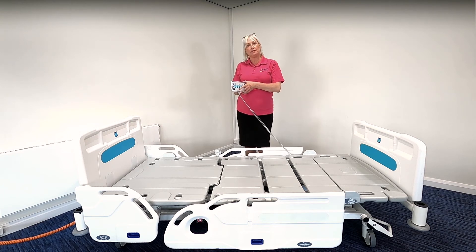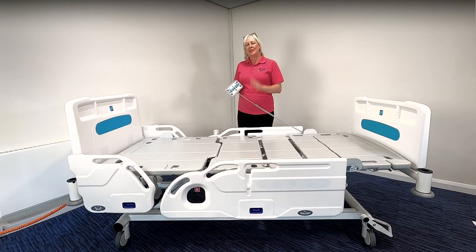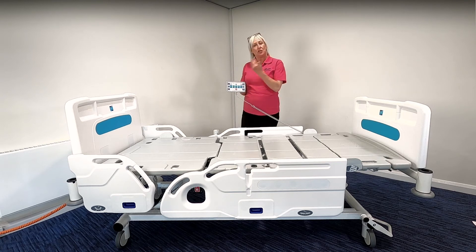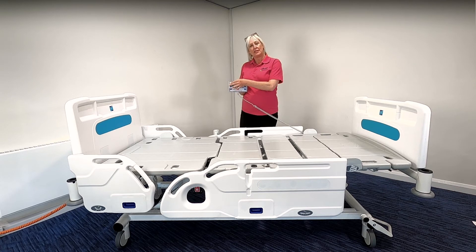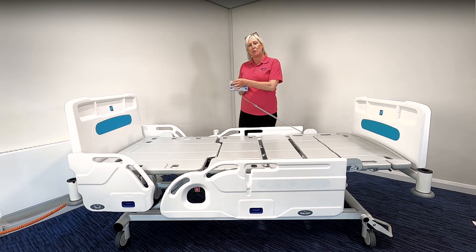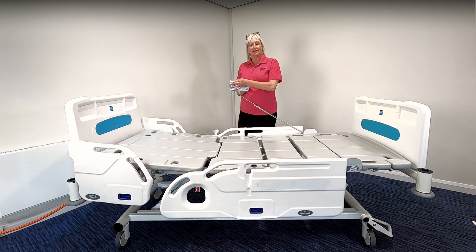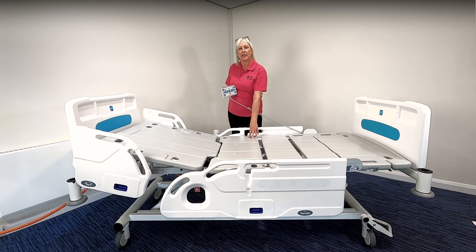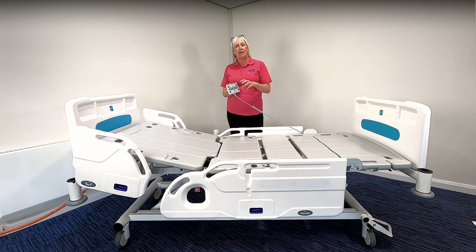Down to the minimum of 34 centimetres. The Innovate IQ bed has an auto-regressing backrest. What that means is when you choose the head of bed profile function and press the up direction button, the backrest will begin to raise. As it raises it also reverses backwards away from the next profile section of the bed. This creates a space in the sacral area and that contributes to minimising shear and friction for the patient.